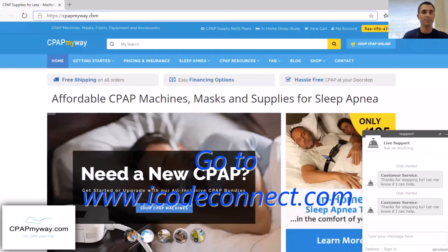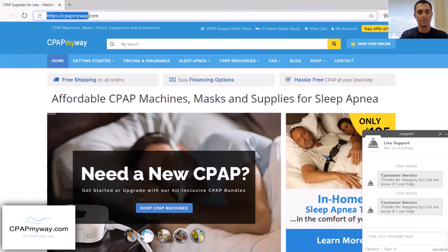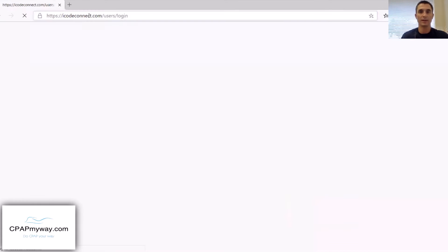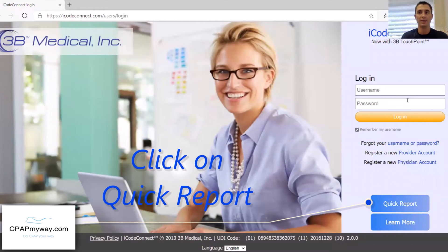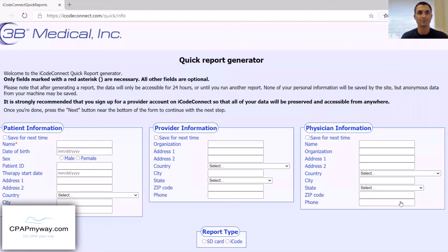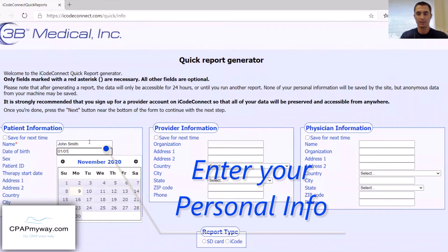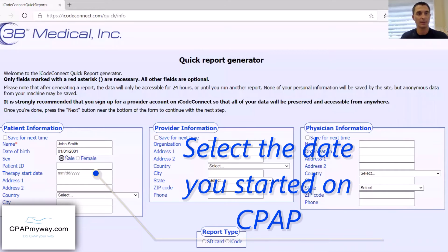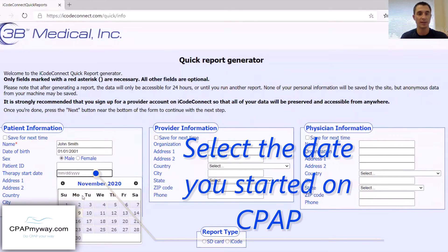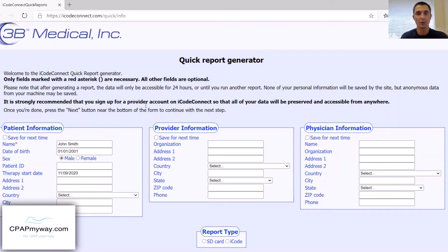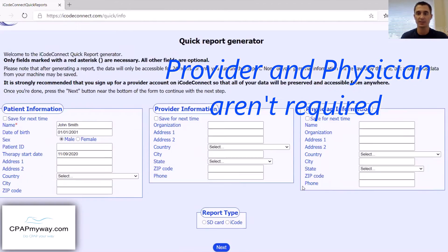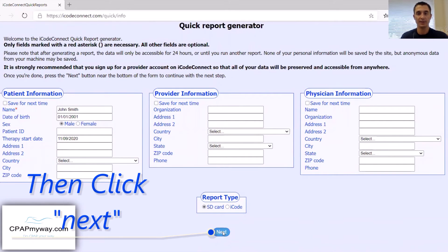Once you've done that, all you have to do is go to icodeconnect.com. From there, you have the login information, but you're going to just go to Quick Report. On Quick Report, you're going to enter your information. It's very important to enter your therapy start date. You can put in your provider information — this would be where you purchased the CPAP from, or your physician information, the doctor monitoring you. Click on SD card and hit Next.